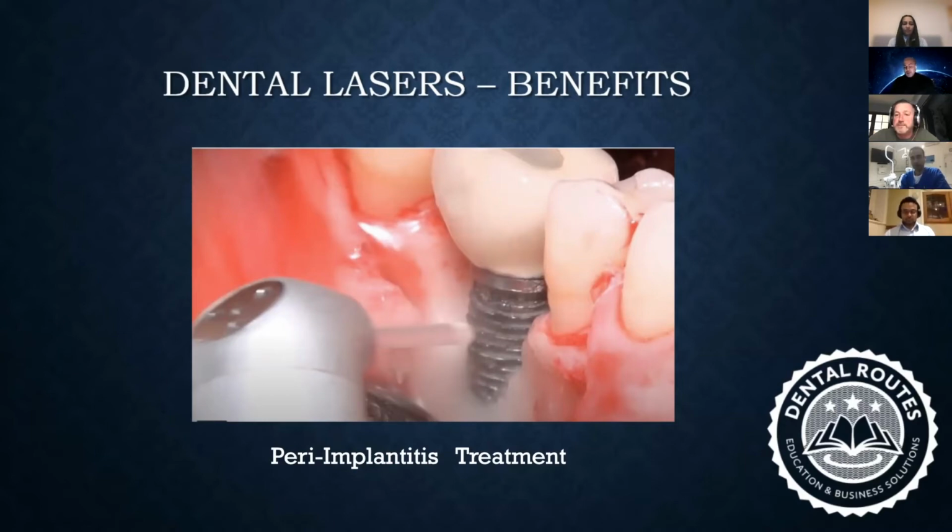Absolutely. That's a wonderful question, because you're talking about the surgical aspect and the placement aspect which the clinicians do. And then you're talking about the maintenance aspect of your teeth, but also maintenance aspect of implants, right? And the big hot topic right now is about minimizing the bacterial flora within your pockets and within your mouth. And one of the big topics again is about how we should use antibiotics in terms of controlling these kind of pathological situations.